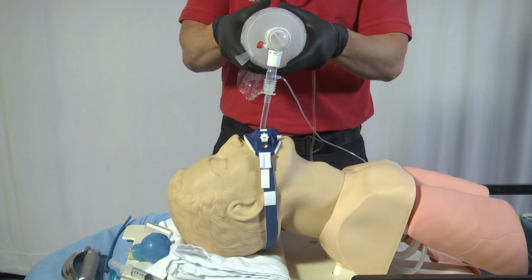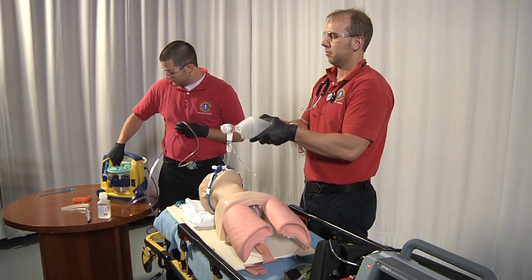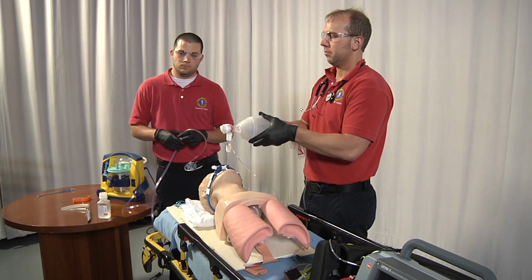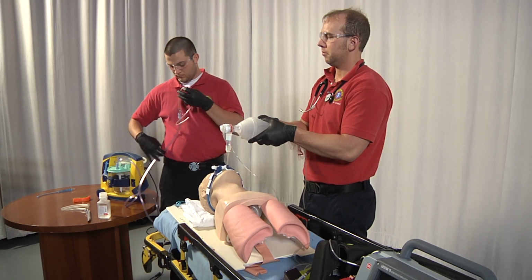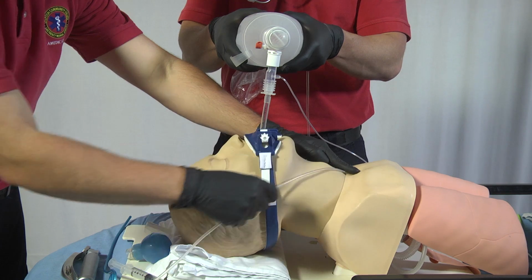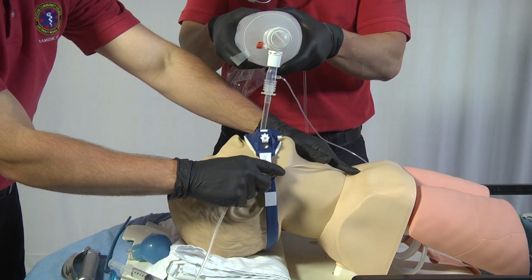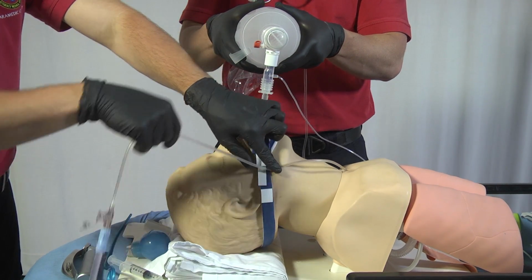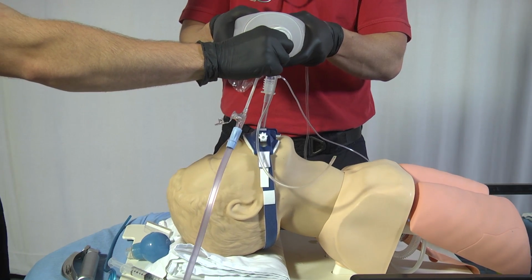Select the appropriate flexible suction catheter and attach to suction. Turn suction to appropriate setting, normally no greater than 80 to 120 mm Hg, and kink or occlude the distal tube to ensure suction is applied. Measure flexible suction catheter. Begin by placing the distal tip of the suction catheter on the sternal notch and hold in place. Now measure from sternal notch to ear, and the ear to the ET connector. Mark measured spot on tube with fingers.